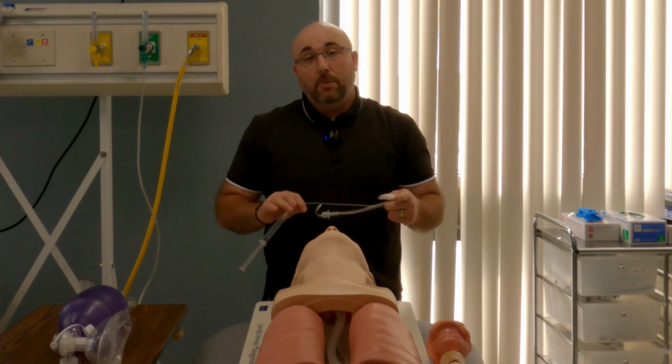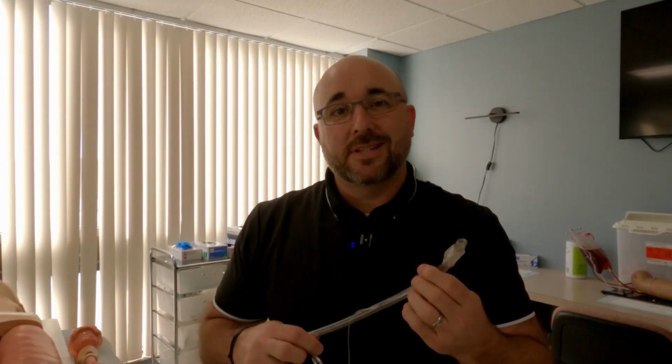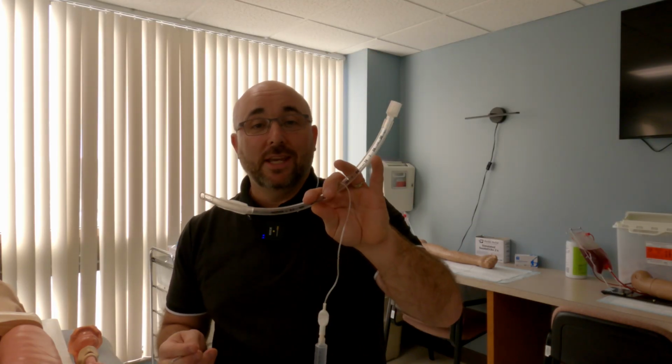Another one is preparing the endotracheal tube. So there's, first one's laryngoscope, we have the bag valve mask, now we have preparing. So the standard endotracheal tube will look something about like this. This is a size 8, as you can see on here, 8.0. That tells you the inner diameter of the tube. Most adults, we're going to use 7, 7.5, 8, 8.5 for those sizes. The person intubating actually picks. And so if I'm in there with a physician, I'll say, what size tube would you like? If they're not for sure, I'll give them a 7.5 or an 8. But those are a couple of real keys when setting this up.